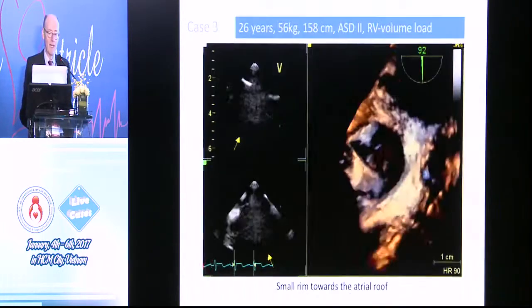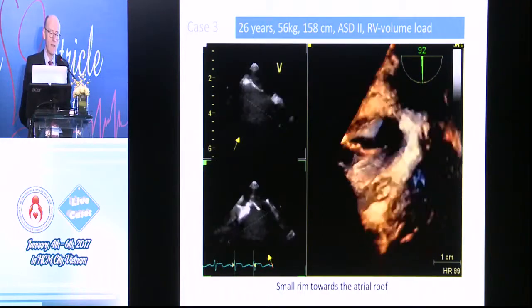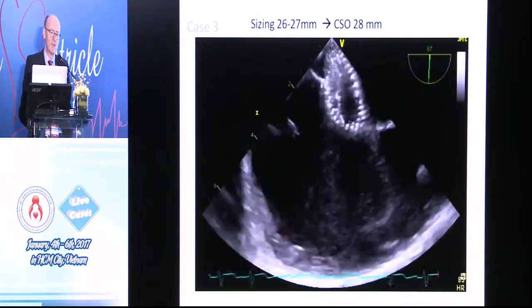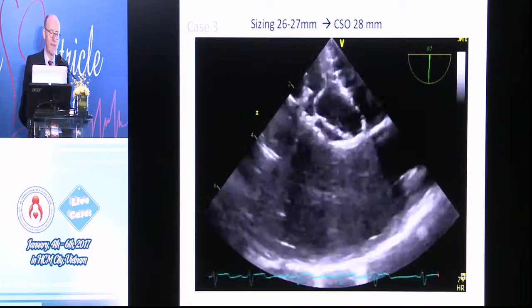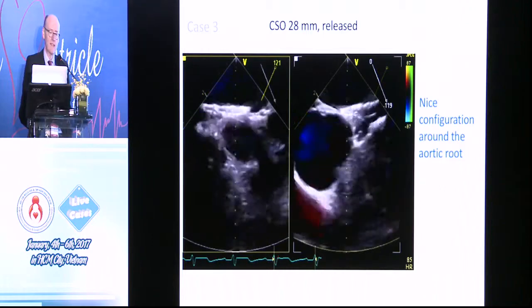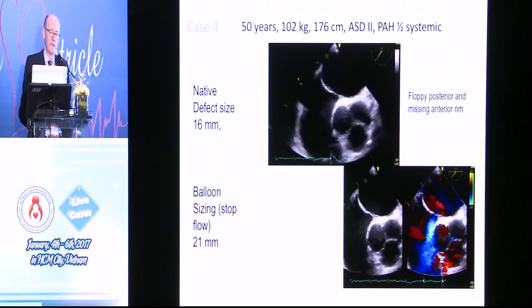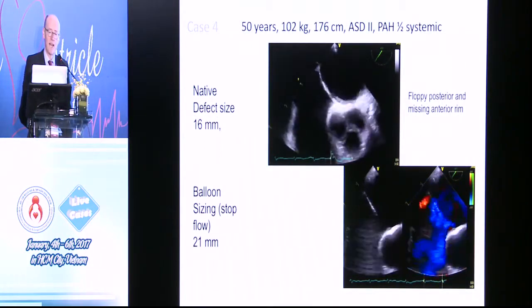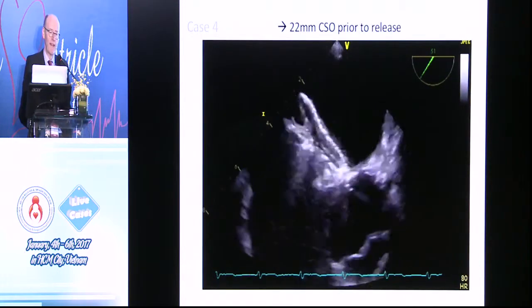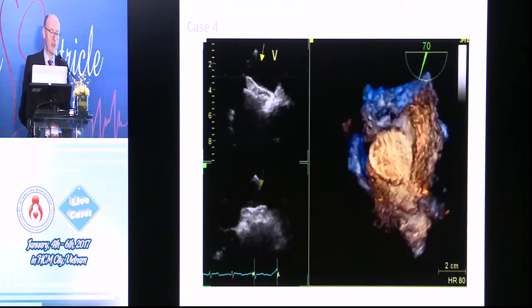Another case — 26-year-old, 56 kilos, 3D reconstruction, reasonable defect, 26 to 27-millimeter on sizing. So a 28-millimeter CeraFlex released. You can see the position, looks nice, nice configuration around the aortic root. And this is what it looks like in 3D. Then a 50-year-old, 16-millimeter defect, balloon sizing, stop flow at 21 millimeters. Device opens nicely — 22-millimeter CeraFlex — good position, nice and flat. And that's at release with very little change in position.